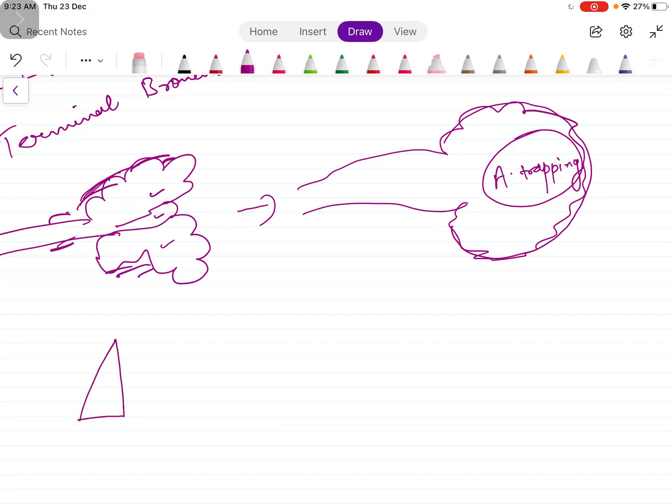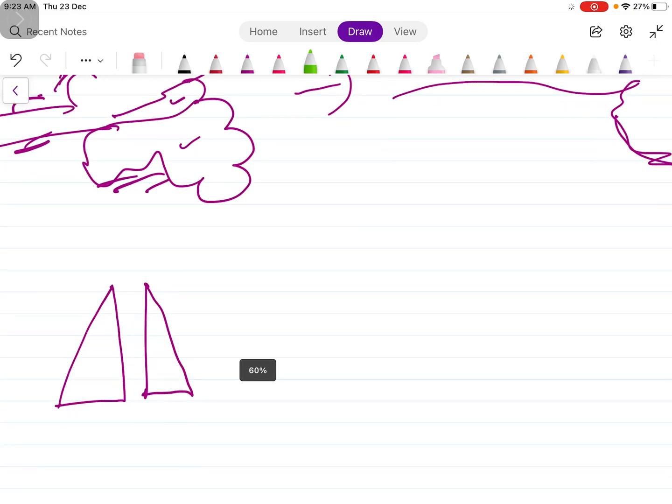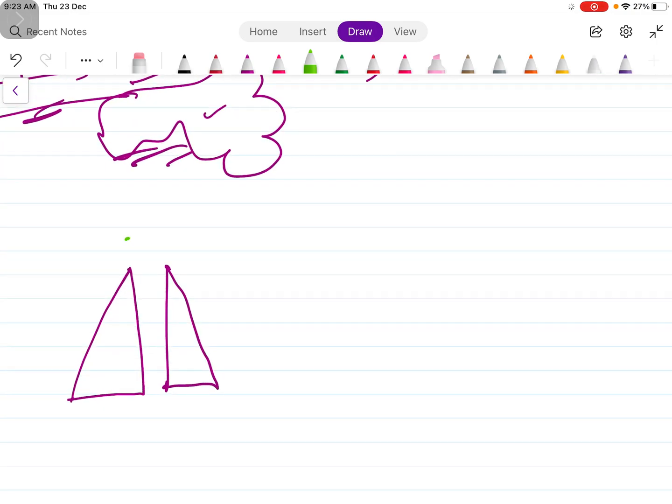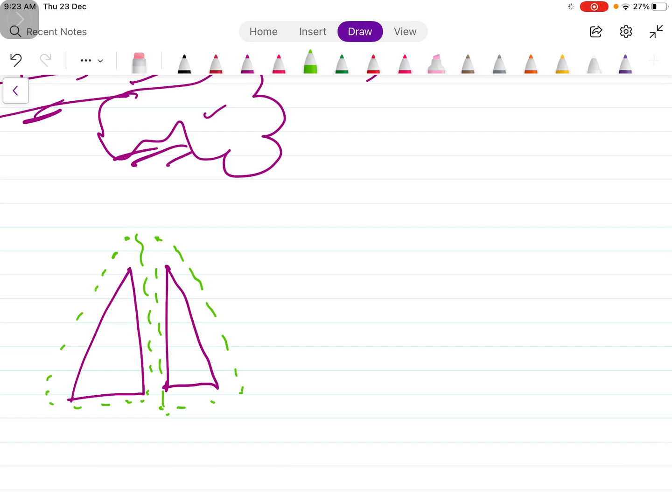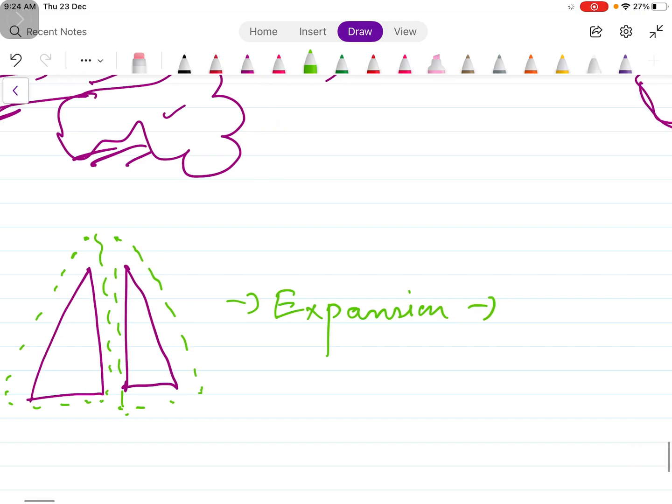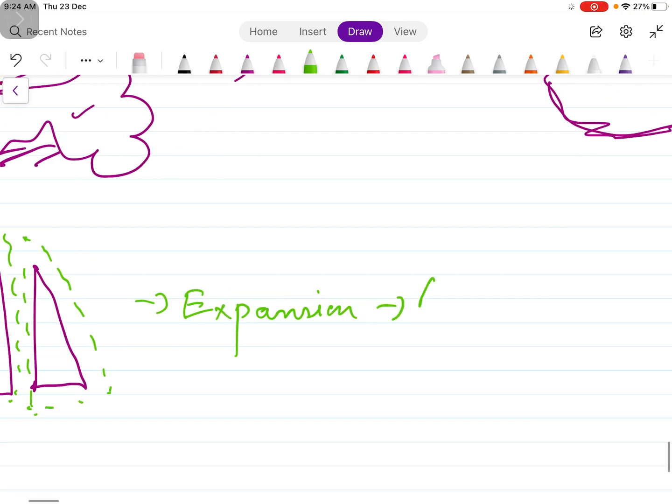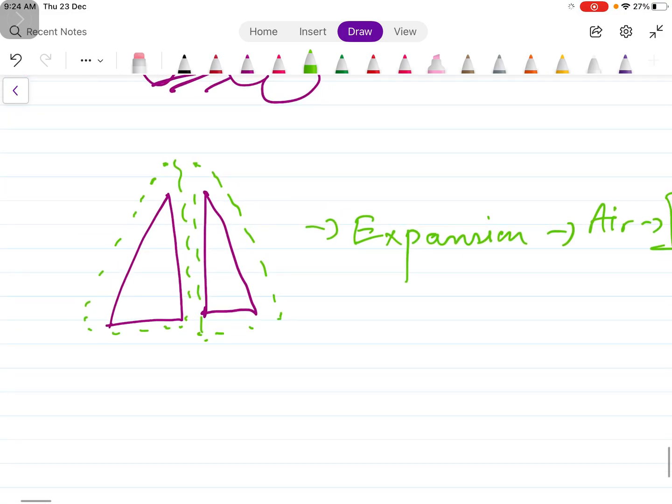So now you can understand that there is air trapping in both conditions. If this is the size of the normal lung, because of air trapping what will happen is the size of the lung will increase. So in the x-ray you can see the expansion of the lung. And if there is expansion of the lung, we know that lung contains air, so in x-ray the lungs will look more black.